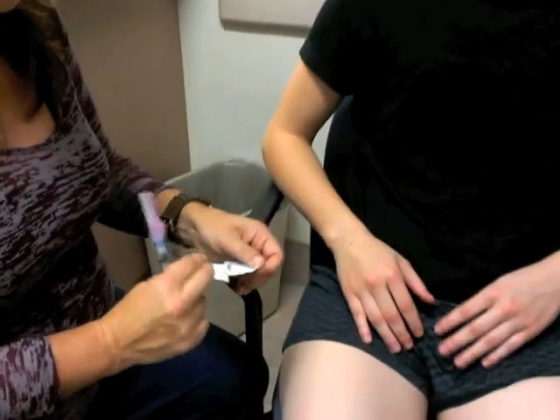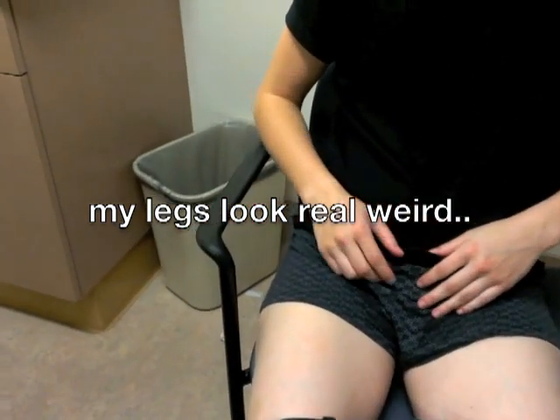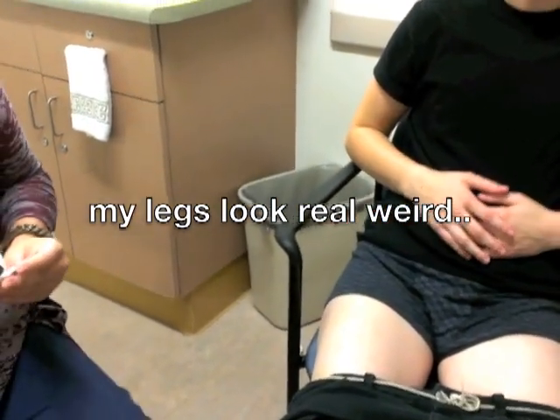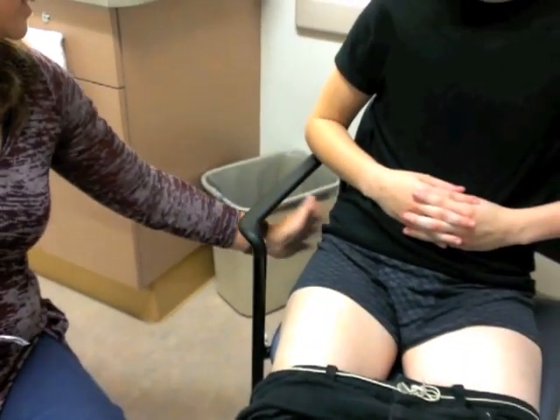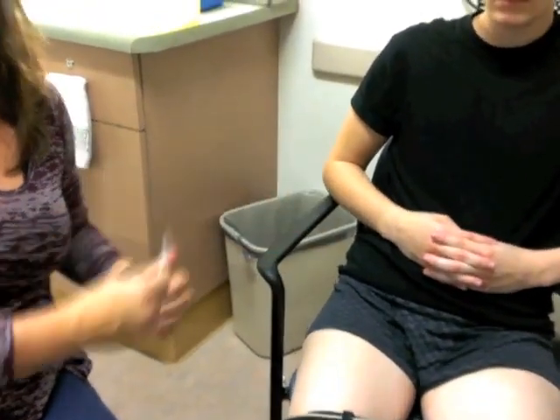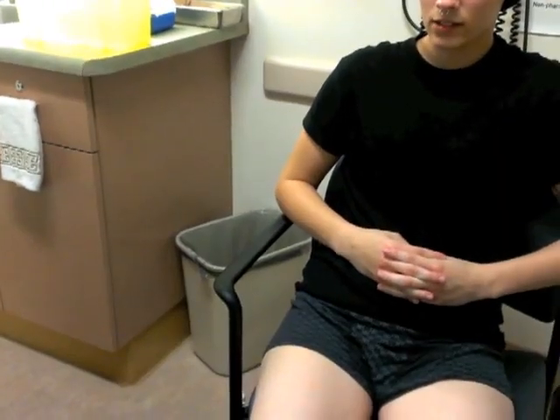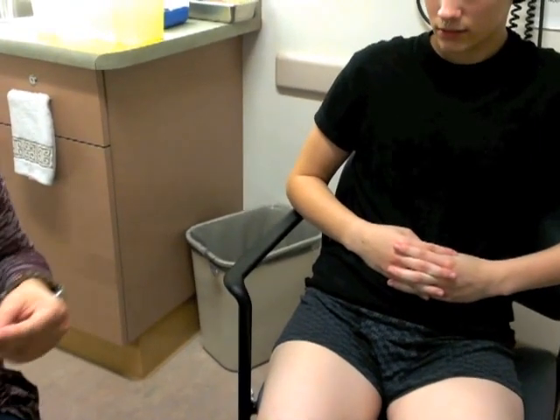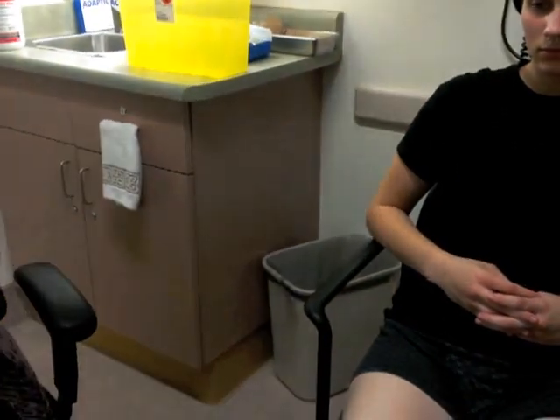Okay, so we're going to swab the area. And I usually let it dry because it just stings if you don't. So in the meantime, I open up a Band-Aid. Let it dry. I don't know why I'm freaking out. Well, I usually give my needles up here, but for safety's sake, we're going to do the thigh. And you could just rotate each thigh from week to week. It's a pretty huge muscle. You've got lots of muscle there. And the way I do it, I just put the Band-Aid on my hand, so it's kind of ready there.